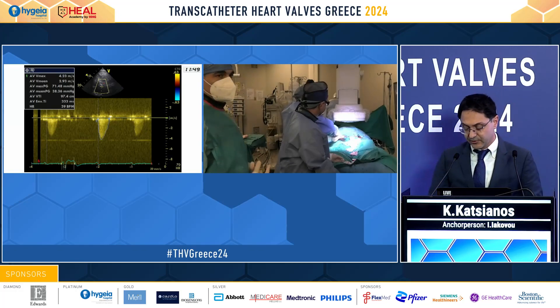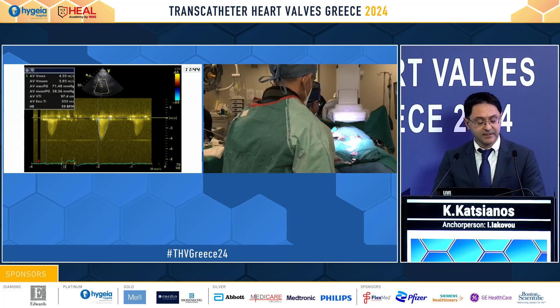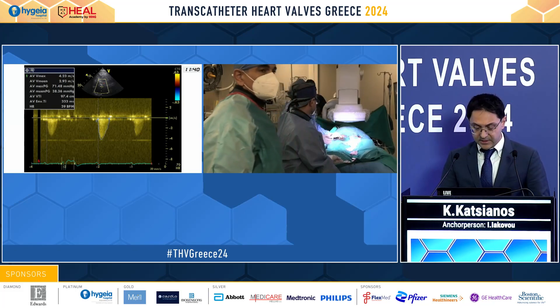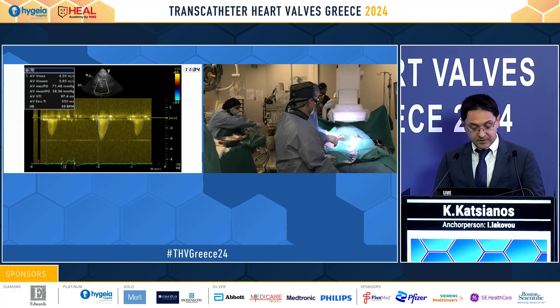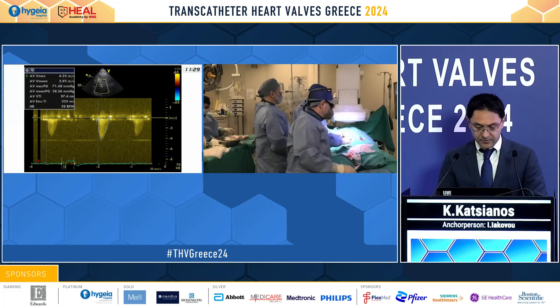Beginning the intervention, we used two ProGlides, one at 10 o'clock and one at 2 o'clock, before introducing our sheath. We see a severe stenosis with a VMAX of 4.23 meters per second.